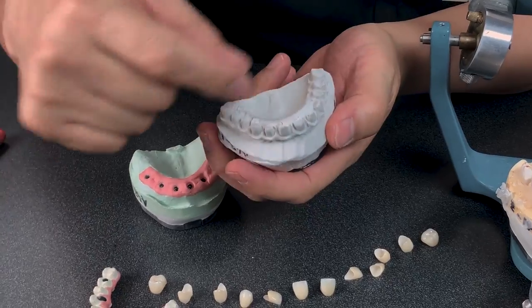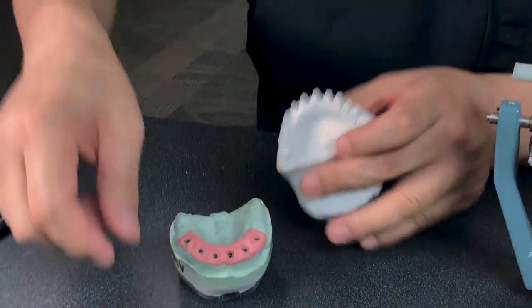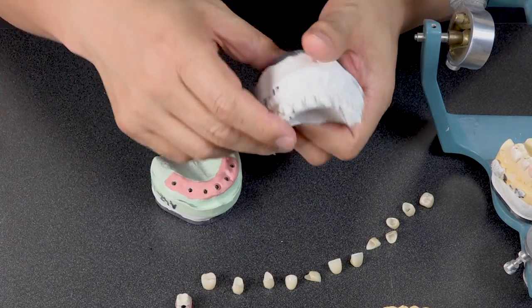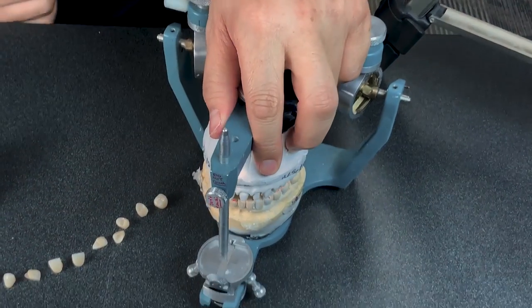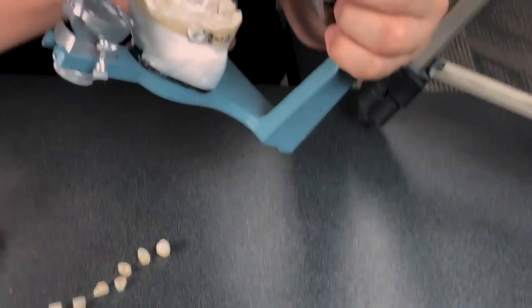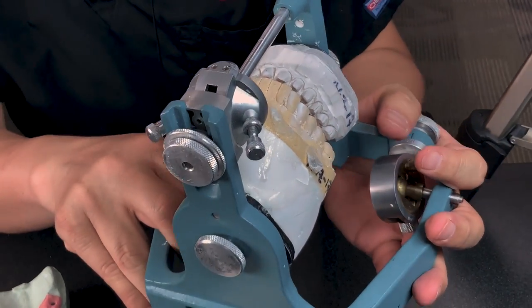So, my technician can scan — you see the whole retention. We had a lot of retention here — that's good. And then they're scanning. They made a hybrid bar from here. So here we check — it's extremely imperative — the contact, and then specific design for those areas.